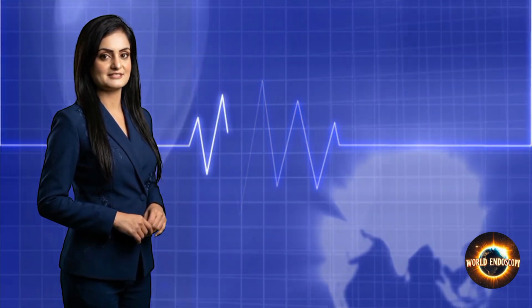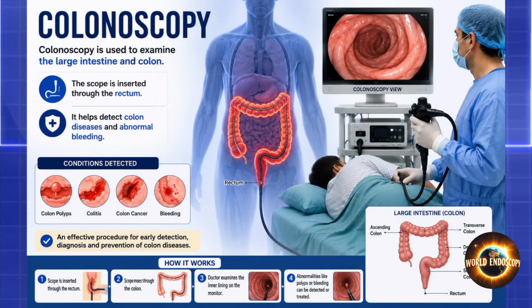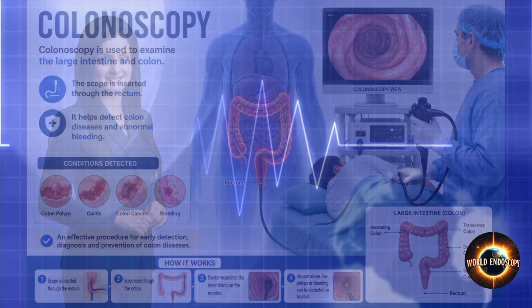Colonoscopy is used to examine the large intestine and colon. The scope is inserted through the rectum. It helps detect colon diseases and abnormal bleeding.